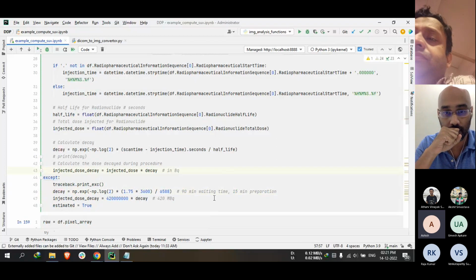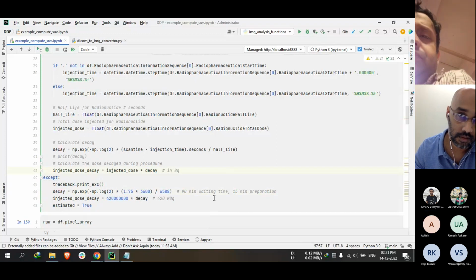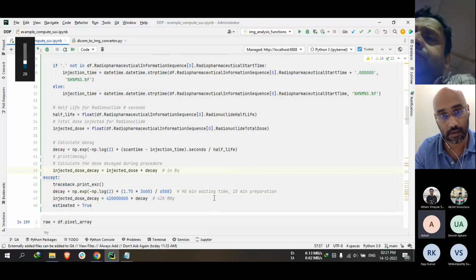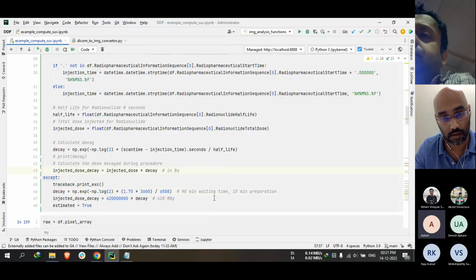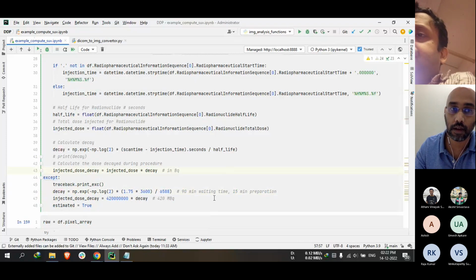I have one more question here. Yes. At the very first place, why do we need to calculate SUV? Because we will then calculate the SUV max from the image. So we'll first need SUV for every pixel. So even we can just calculate intensity max. How will it be different than calculating SUV max? Because we will use the SUV max data as future input variables for risk factor stratification.